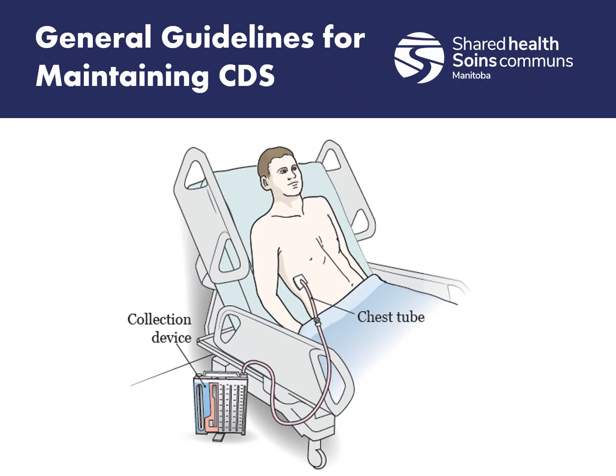So when we're transporting, just like any other patient, we're going to be wanting to monitor our vital signs. The big ones we're going to be looking at for these patients, though, is going to be your oxygen saturations, your rate and quality of respirations, and you could even consider using your nasal end tidal CO2. So we can monitor oxygen coming in, CO2 coming out. So that's what we want to look at.